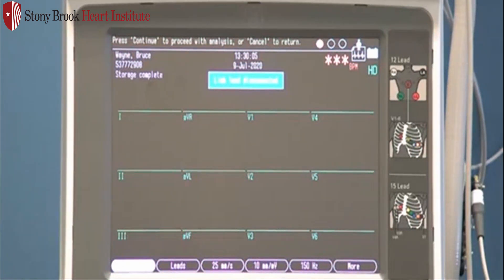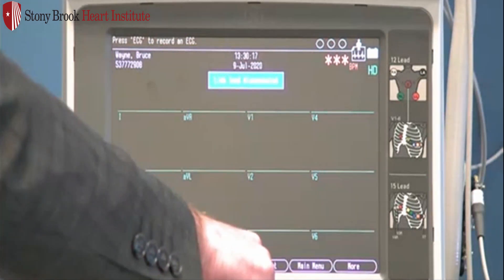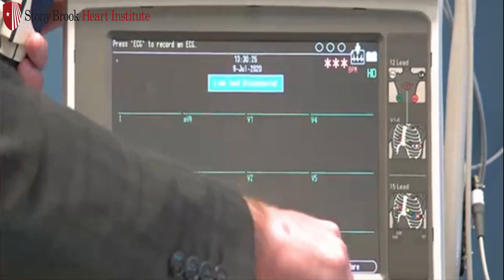The patient test will print and will also be stored in the file library. Once the test has done printing, select F4 or Next Patient. This will clear out the current patient demographics. To transmit the study, we want to use the More option, F6.